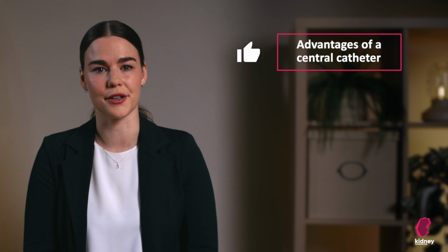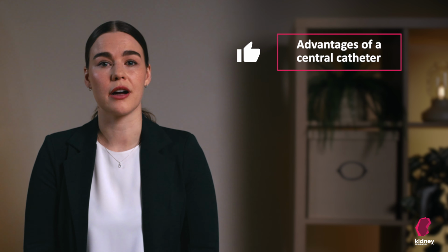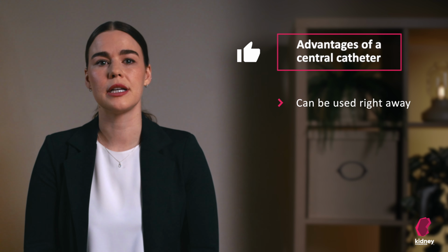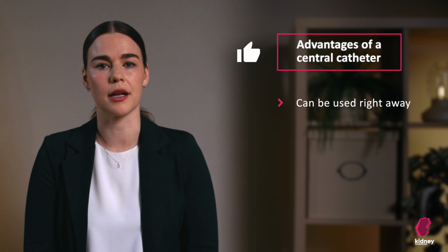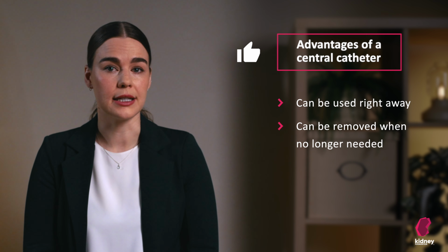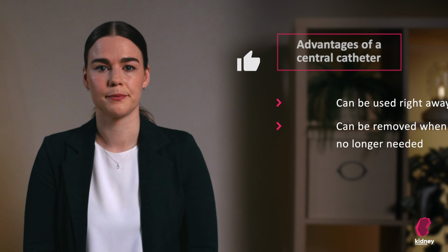Advantages of a central catheter. The main advantage of the central catheter is that it can be used right after it is put in, whereas you need to wait several weeks before a fistula can be used. Also, when it is no longer needed, a catheter can be removed.